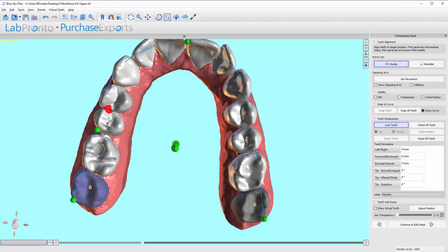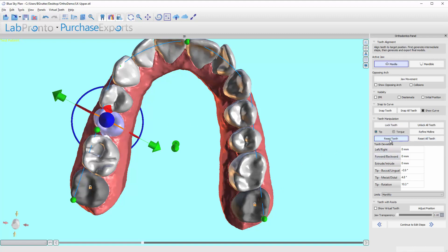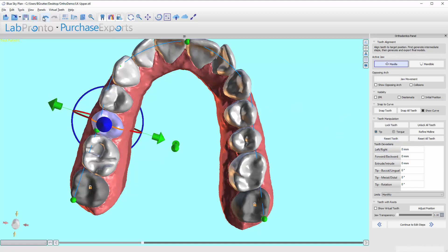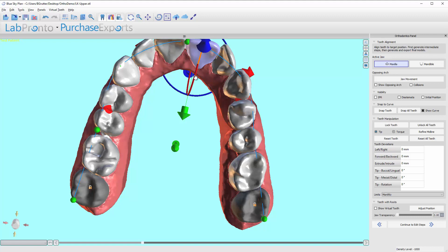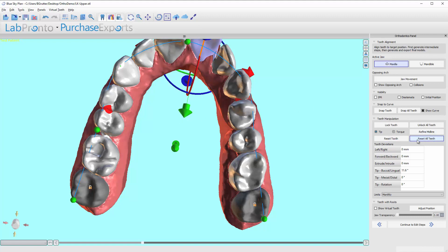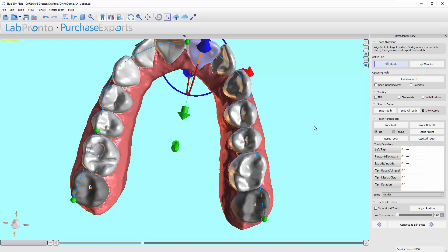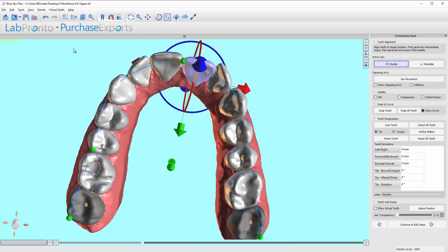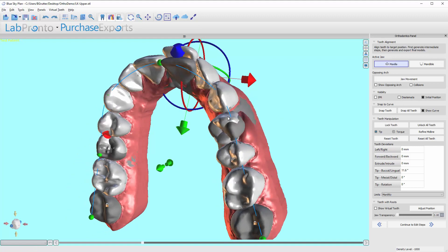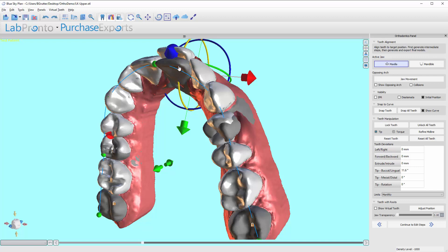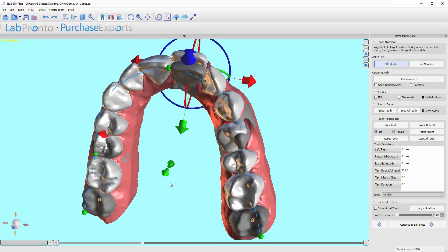I can also click on a tooth I moved earlier and reset it back to where it was, and if I didn't mean to reset it I can undo. If I have moved many teeth, I can 'Reset All Teeth' and they go back to where they were. There is also an 'Initial Position' button — clicking it shows the dark gray where the teeth were, giving a good comparison to see where we started and where we are now.